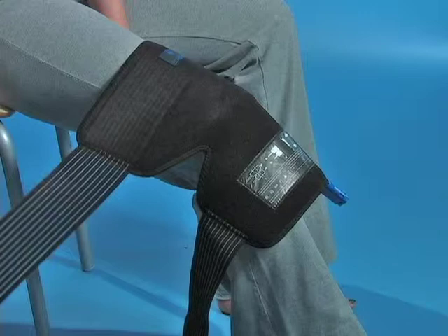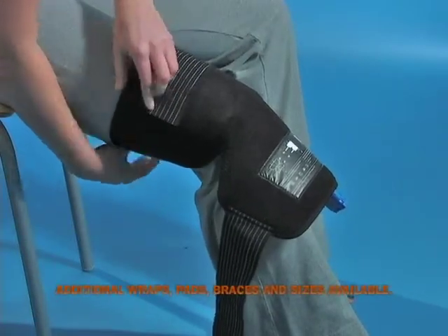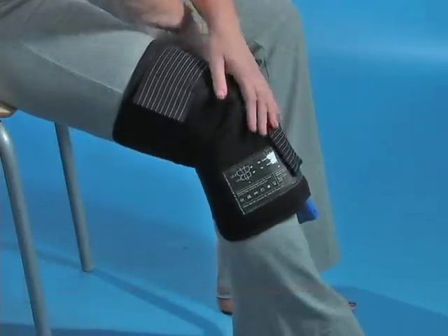Place the center of the wrap onto the knee with the tubing set connector pointing down the leg. Make sure the bladder portion of the wrap is facing down and is on top of the knee. Continue to wrap the top and bottom portion snugly around the knee. Finish wrapping using the Velcro closure.